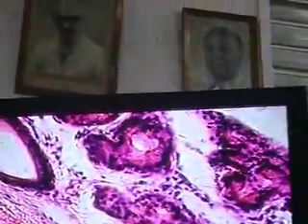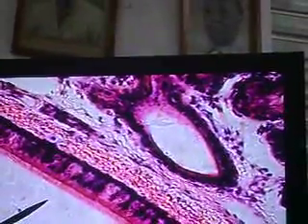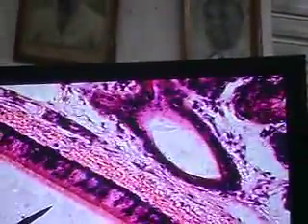So this is all to do with the mechanism of mucociliary action, moving the captured foreign objects, stuff that's trapped in the mucus, and pushing it up. These are the goblet cells right here. So this is pseudostratified columnar epithelium with goblet cells and ciliated cells. This is a beautiful picture here of the cilia. The cilia are very, very well developed here, and it rests on a very distinctive basement membrane.